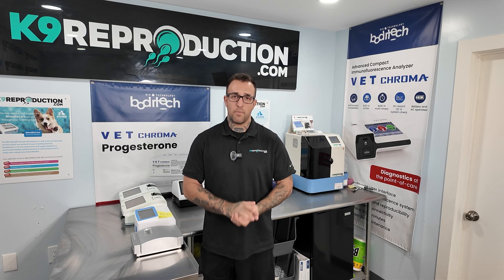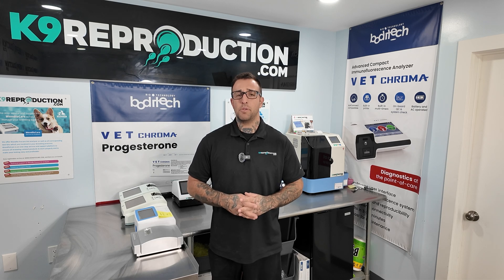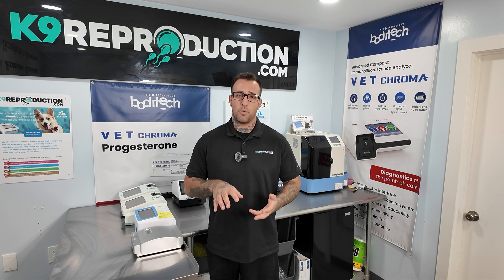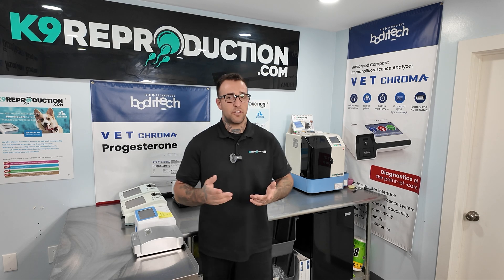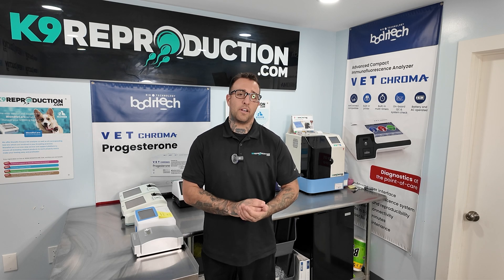Travis with CanineReproduction.com. Today we're going to take a close look at some canine progesterone machines and teach you guys a little bit about them, helping you get to know the whole idea of progesterone testing in general, as well as what machines to buy, not to buy, and things to look for. Stay tuned and follow along — hopefully this will be a great guide for you guys looking to get into your first progesterone analyzer or upgrade from one you're not happy with.